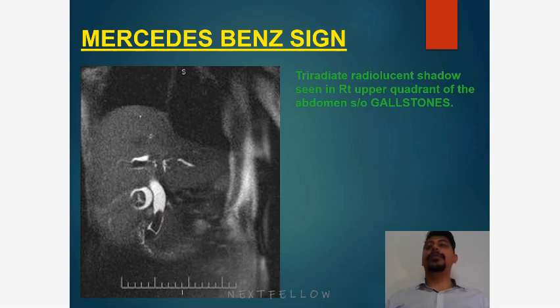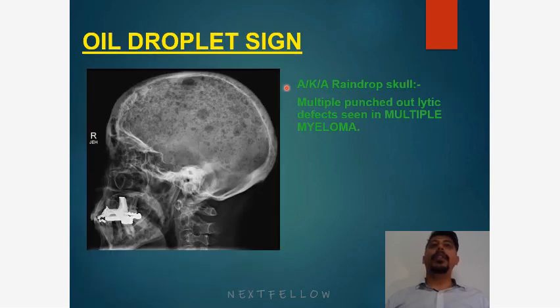Oil droplet sign, also known as raindrop skull, multiple punched out lytic defects seen in multiple myeloma, called as oil droplet sign or raindrop skull.